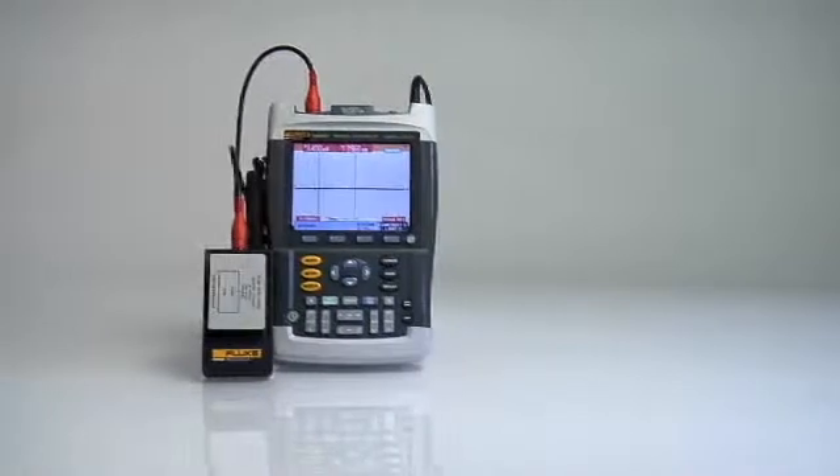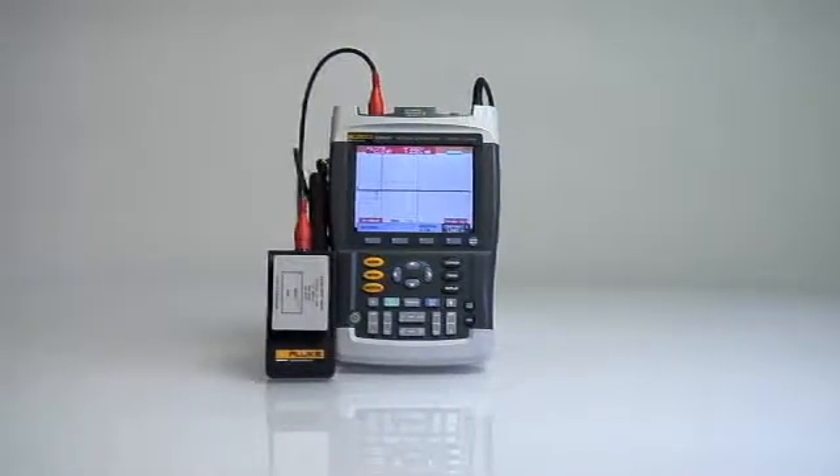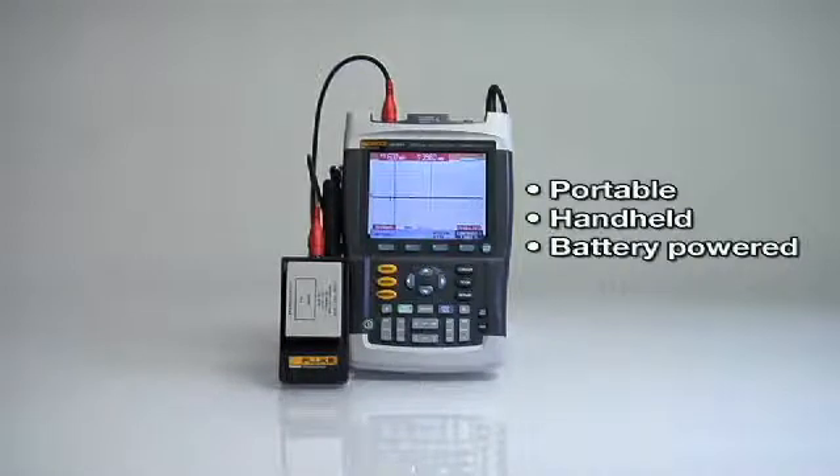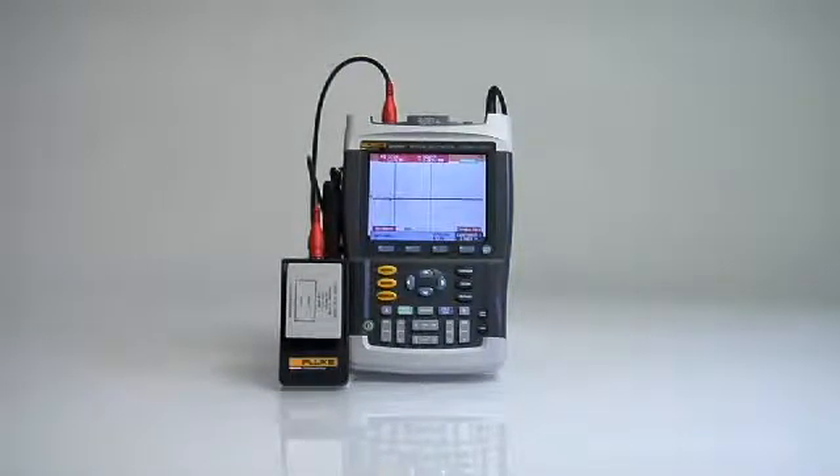The 199 X-ray medical scope meter offers specifications found on top-end bench oscilloscopes in a portable, hand-held, battery-powered instrument that is ideal for use in the X-ray diagnostic imaging environment.